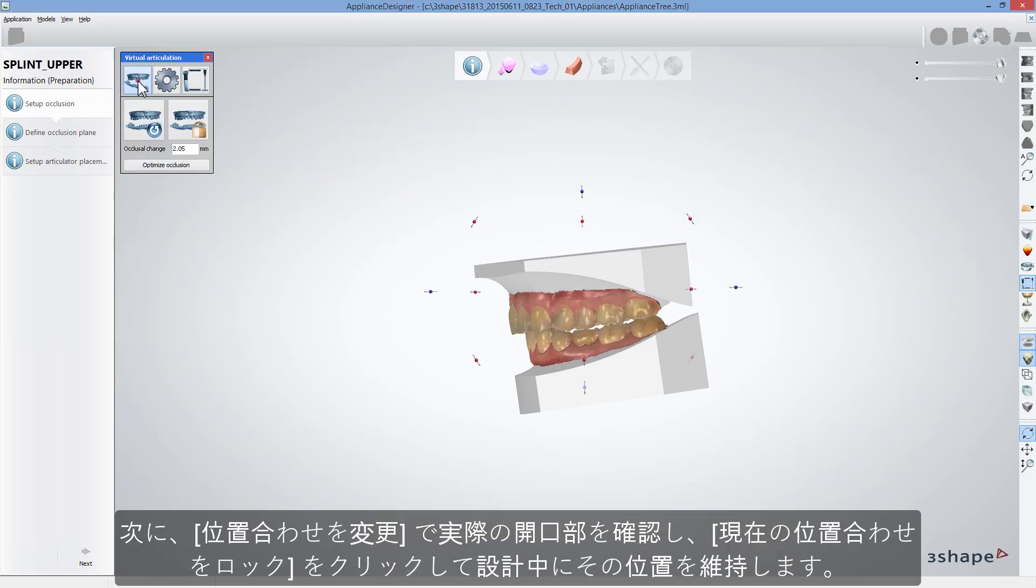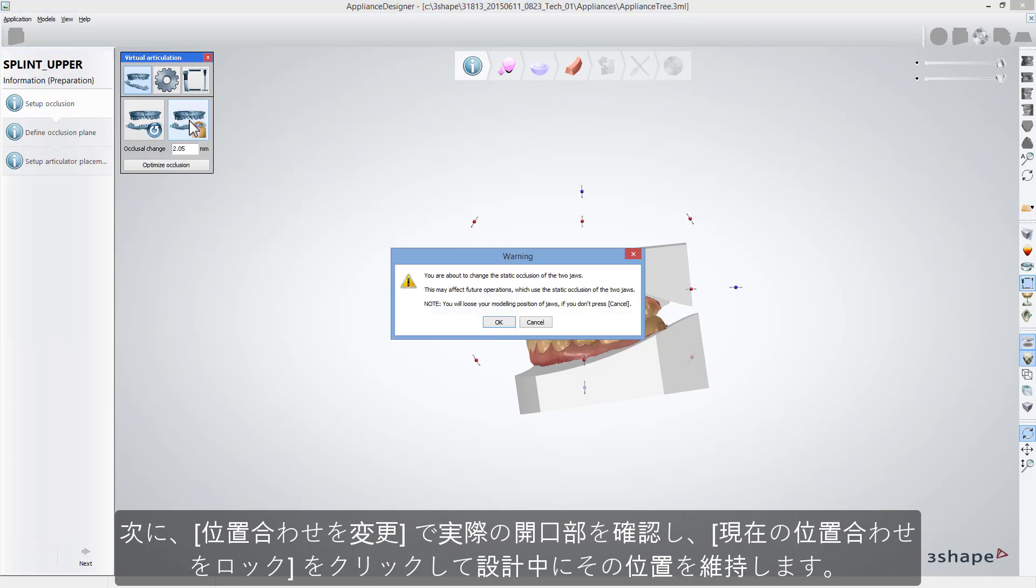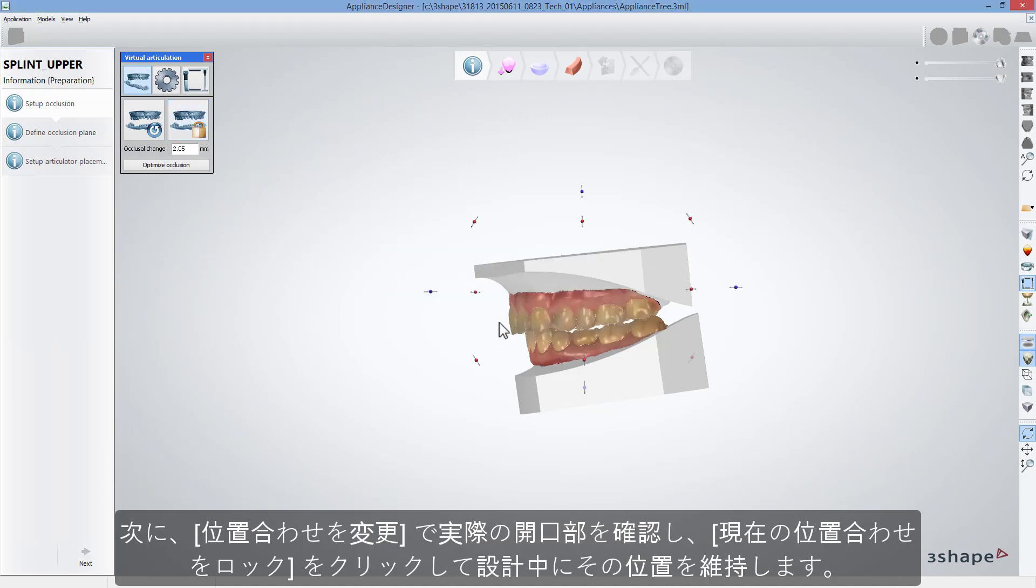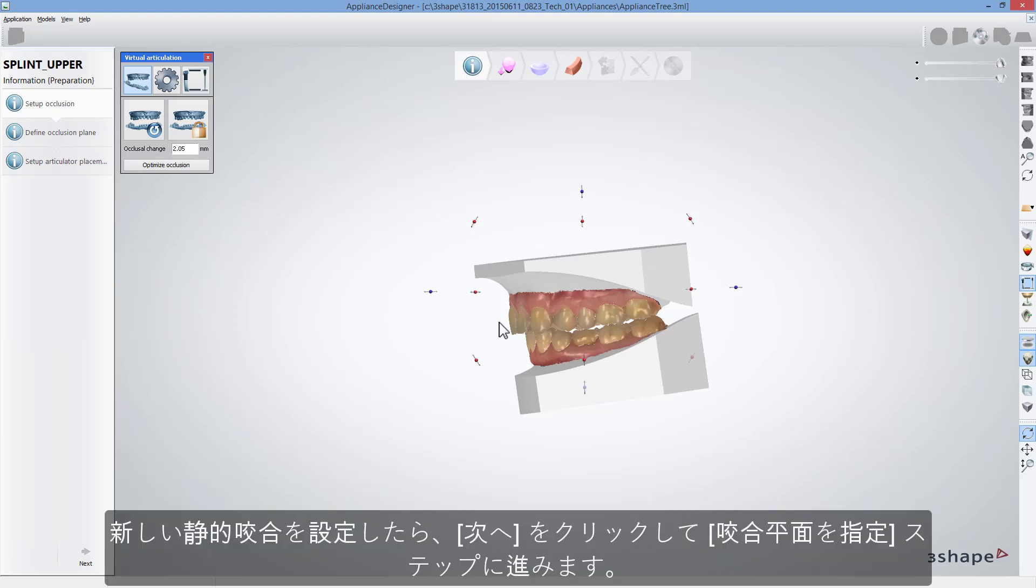Then go back to Modify the alignment to see the actual opening between teeth and click Lock the current alignment to keep that position during design.